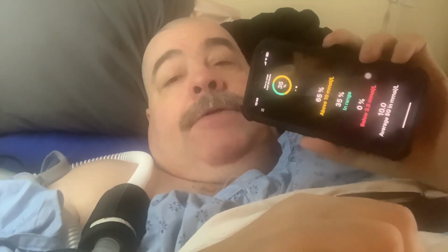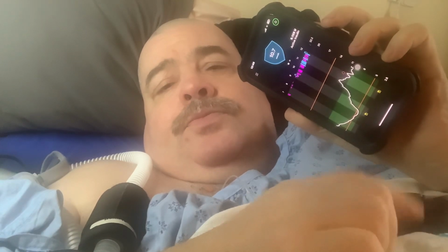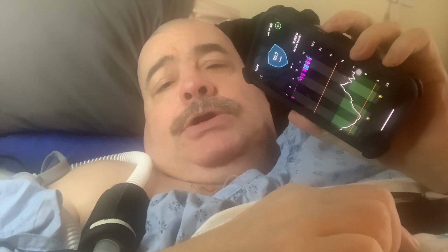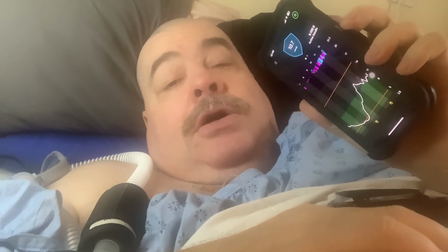Gone are the days where every diabetic had to write meticulous notes. You had a low blood sugar. Why did you have a low blood sugar? It was a lot of extra time. Utilizing your pump and the information allows you to take a look at things and, maybe we need to increase insulin or speak to your doctor.